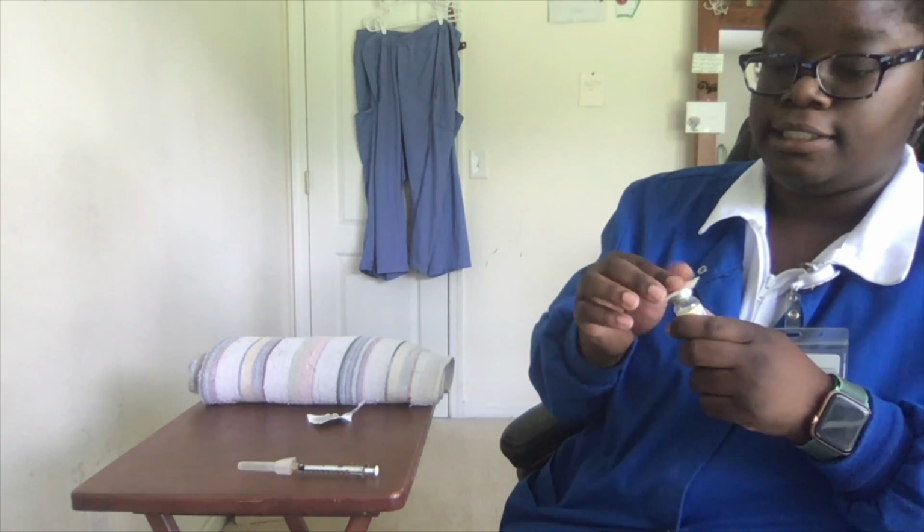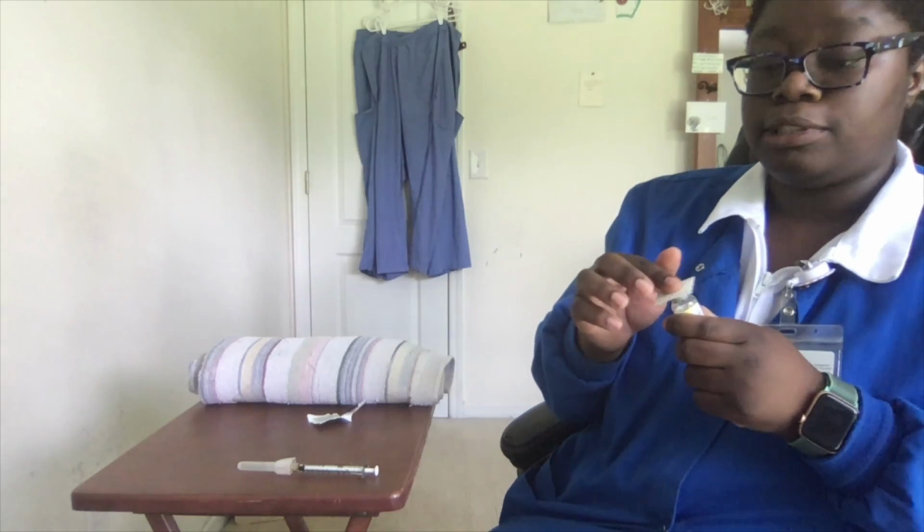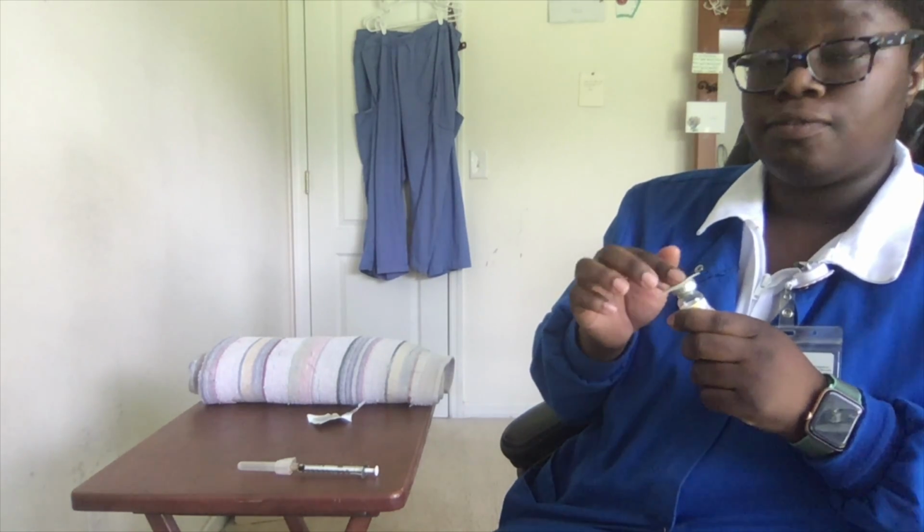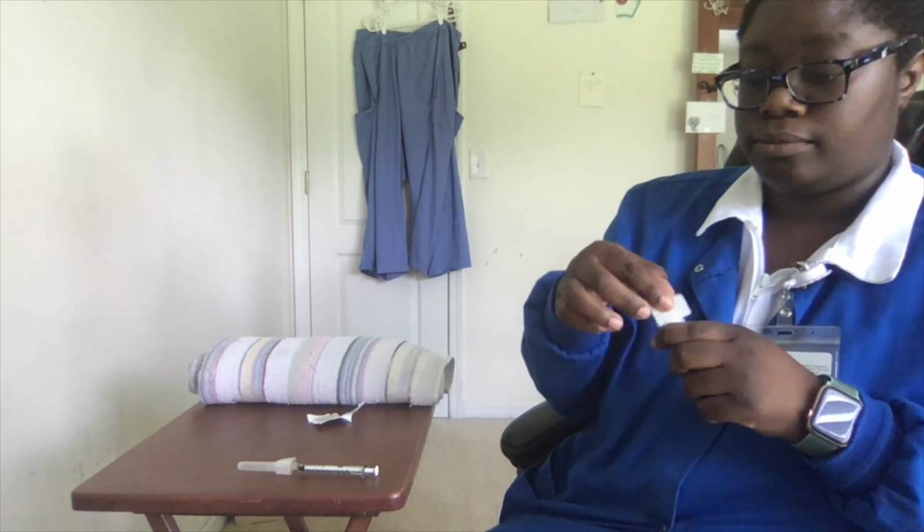I'm verbalizing that I've rubbed this rubber stopper as well as the entire top of this vial for 30 seconds and allowed it to completely air dry.